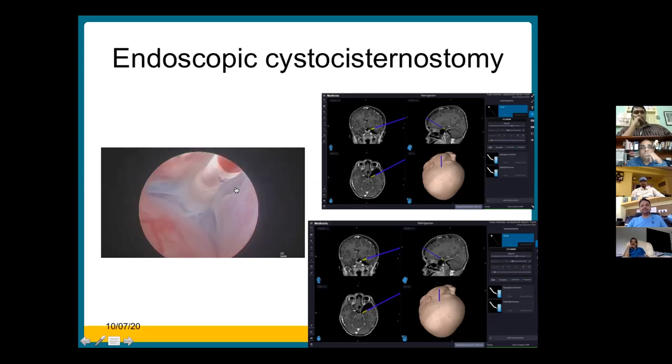The navigation is just required for the initial part, but after that it's based on anatomical landmarks. After you do a puncture, we dilate it with a 4 French Fogarty, which is better, because a 3 French Fogarty is soft and a 4 French is more rigid for opening up these things. You can see the branches of the internal carotid, I presume. So we made multiple openings into this. Once you are sure that there is nothing below, we even used scissors to cut it open slowly and communicate it. We made multiple openings, and then opened it up.